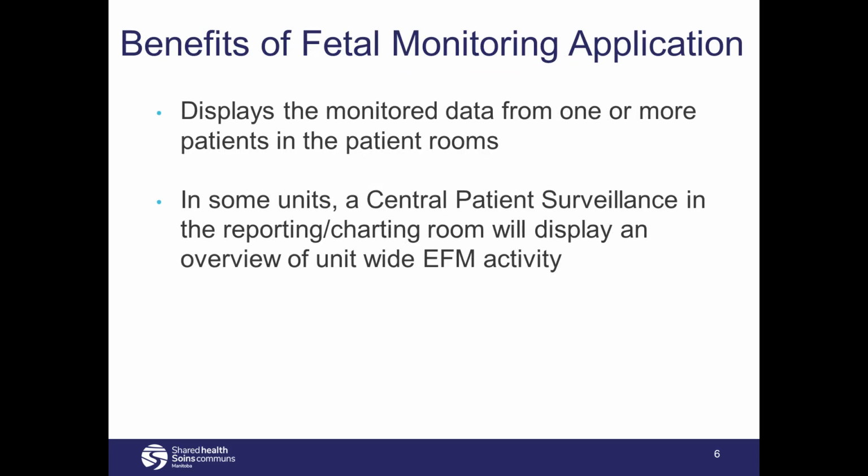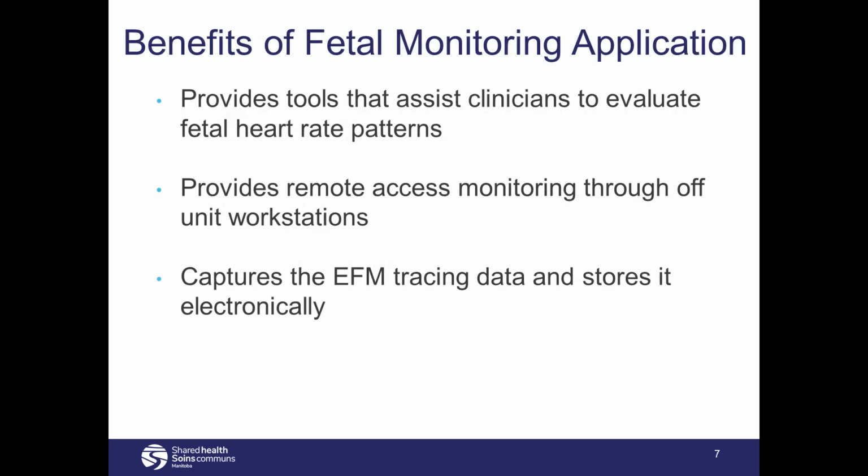Benefits of the fetal monitoring application include that it displays the monitored data from one or more patients in the patient rooms, and that in some units, the use of a central patient surveillance will display an overview of all EFM unit-wide activity. Additional benefits include that it provides tools to assist clinicians in evaluation of fetal heart rate patterns, that it provides remote access monitoring outside of the patient room, and that it captures the EFM tracing data and stores it electronically.